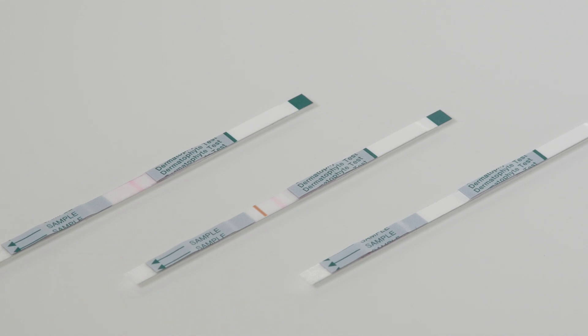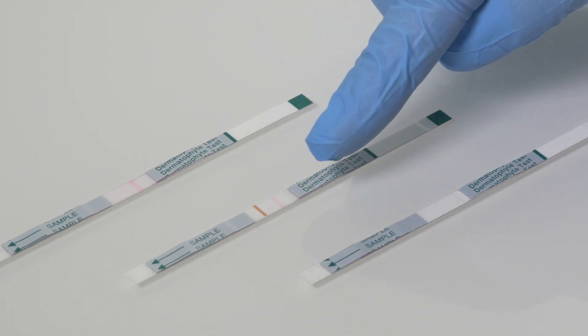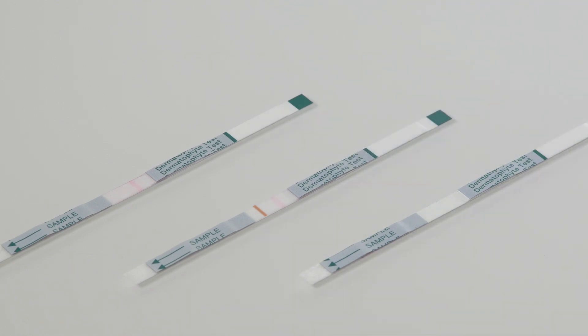The second strip shows a pink line, and just below it has a purple-brown line. This indicates the test is also successful, but there is a positive diagnosis of a Dermatophyte nail infection within this sample.